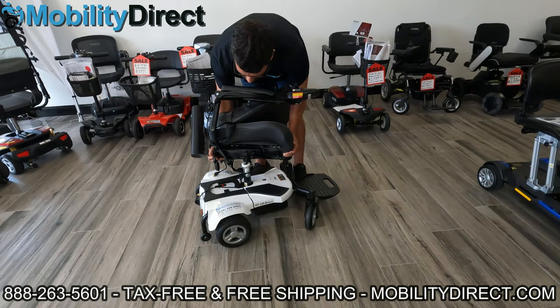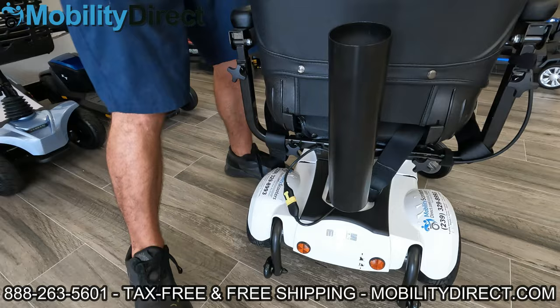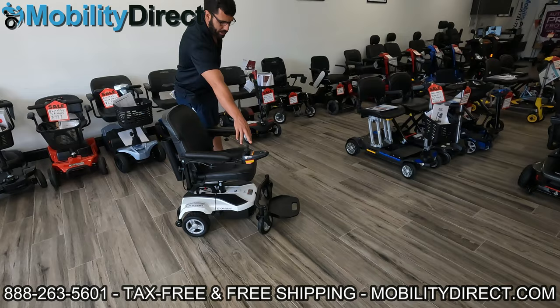I'm going to put it back — line it up, level out the chair, let it drop back into place, and then reconnect the joystick. Now we have power once again. The power wheelchair is functional and ready to go.